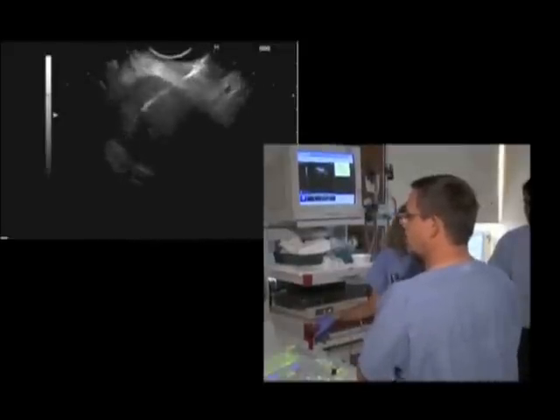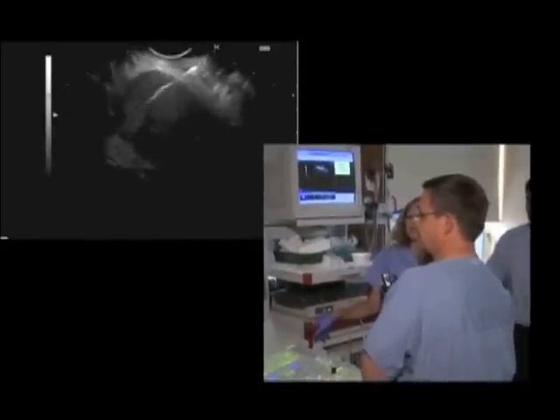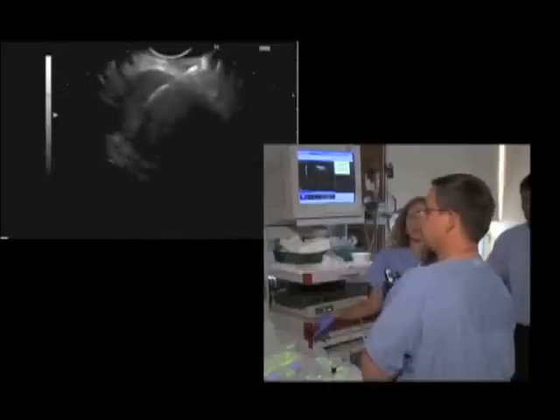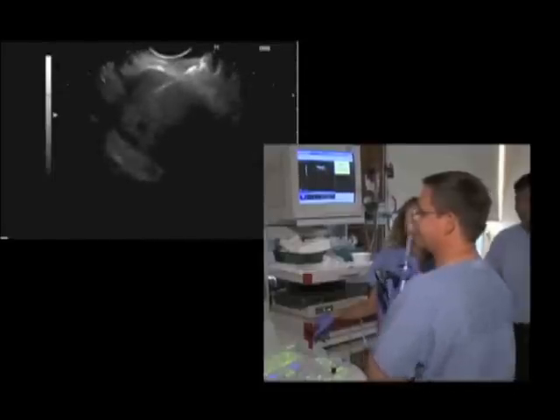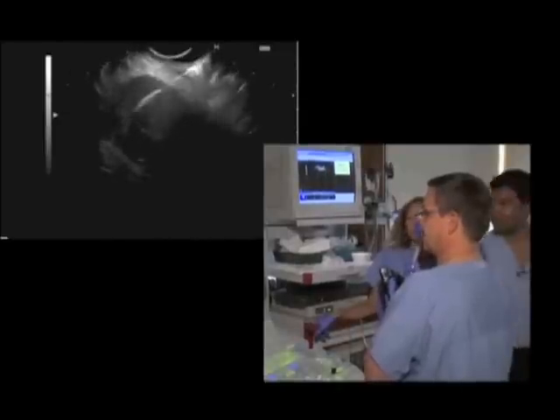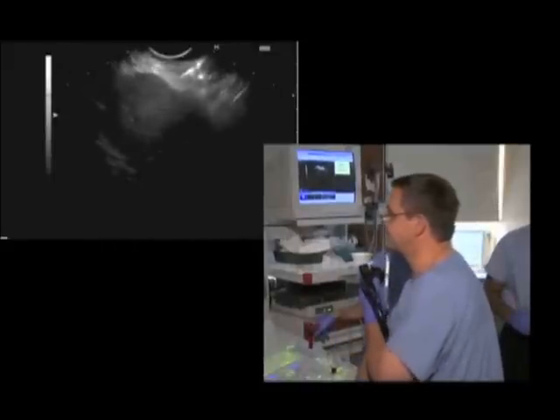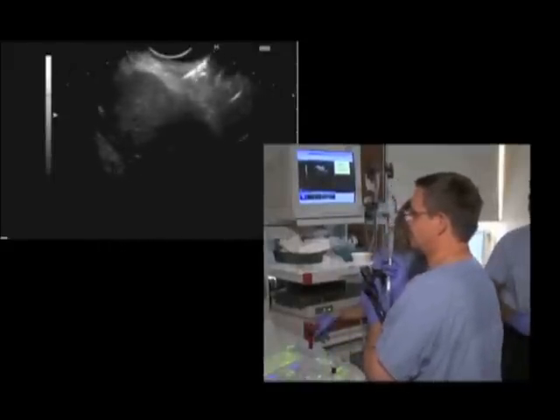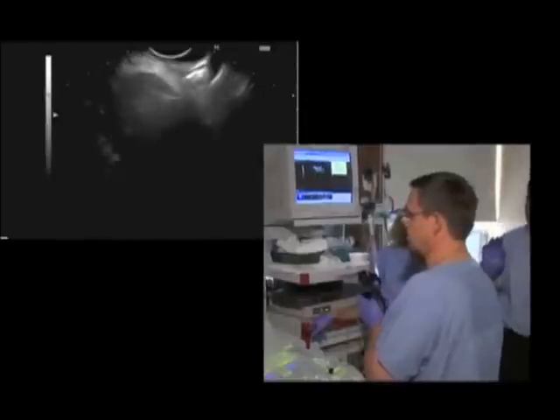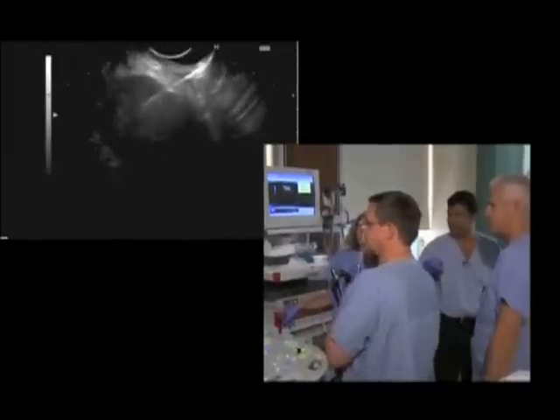Here we go — we are in. Maybe the needle is defective? No, but it will come. The problem with these big lesions is that they can have necrosis or pancreatitis. You think you're sure you have good tissue, but sometimes the pathology is quite difficult.